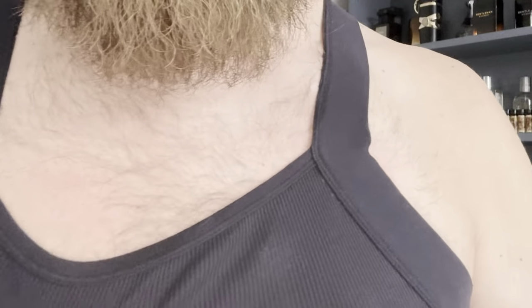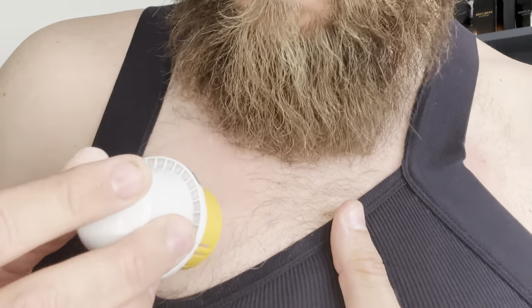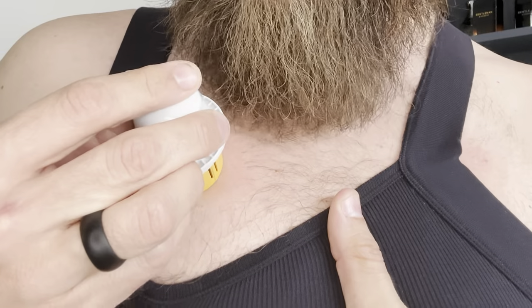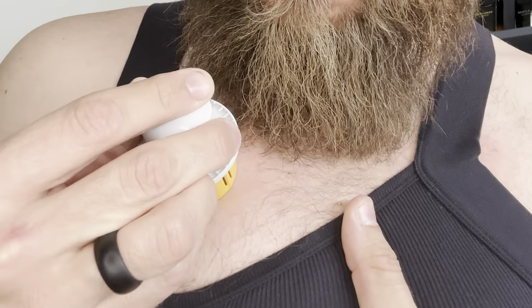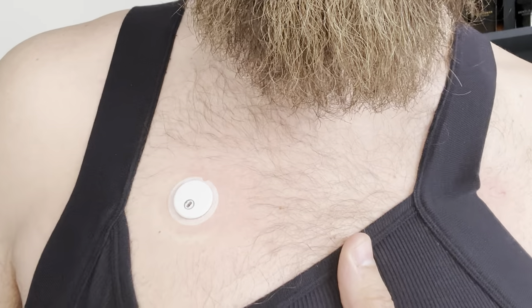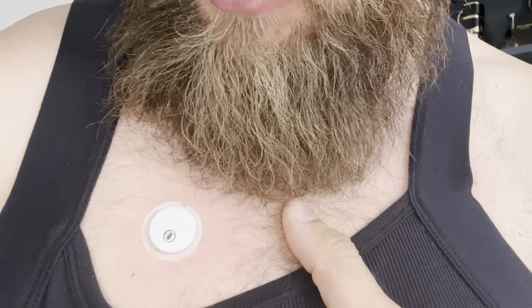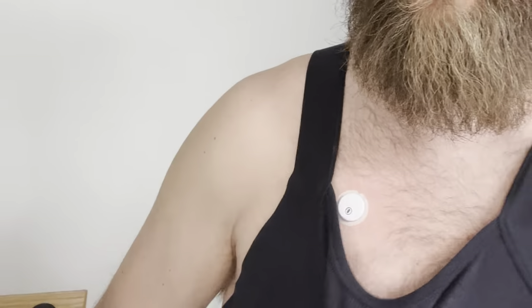So with that said, here we go. As you can see, I got the area trimmed off. I put it right here — just like that guys. Does it hurt? Absolutely not. Now there it is underneath — good to go. Now I can scan my new sensor and be on my way.